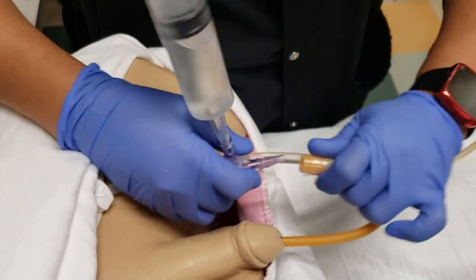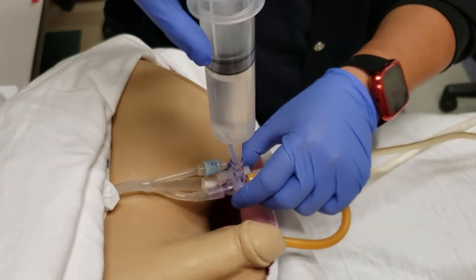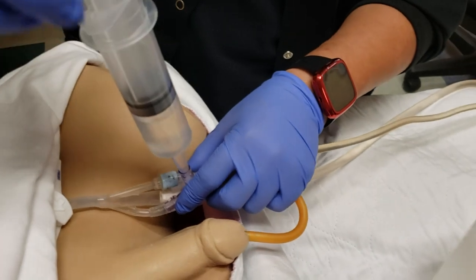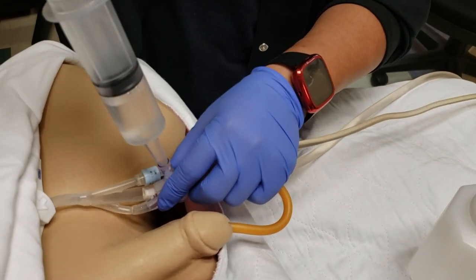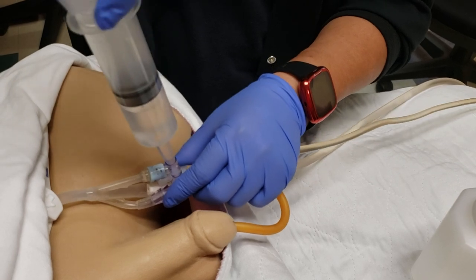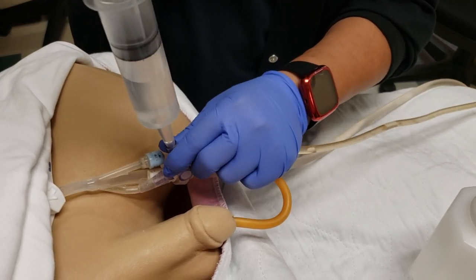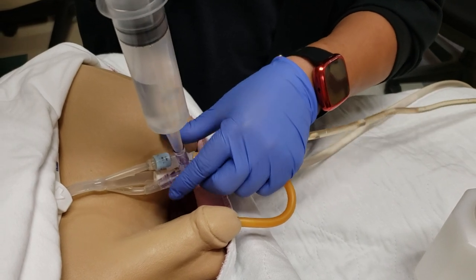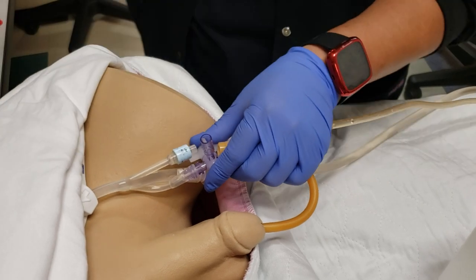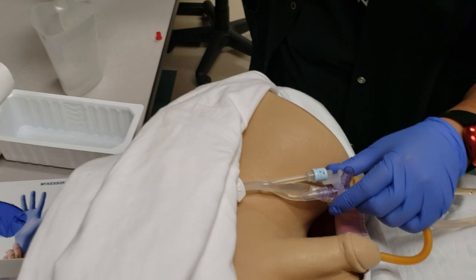Perform the same push-and-aspirate technique as before: push in, aspirate, push in, aspirate, push in, aspirate — until you've removed all the blood clots. Remember to keep the syringe tight on the port, as it tends to pop out. Once you've collected the clots in the syringe, empty them out and discard.